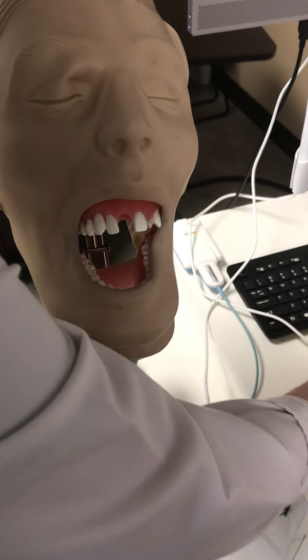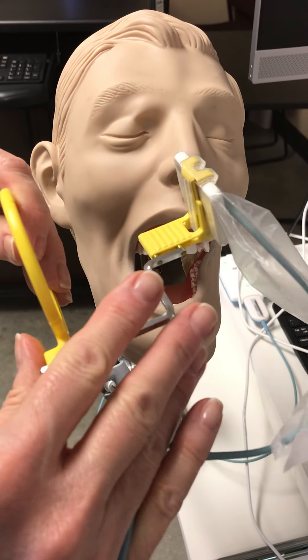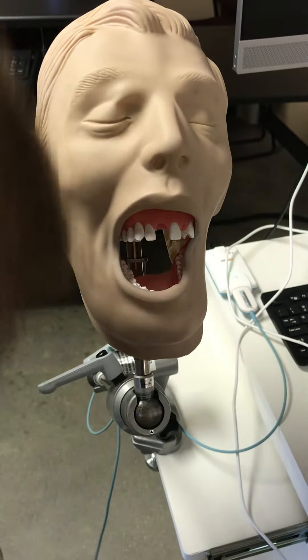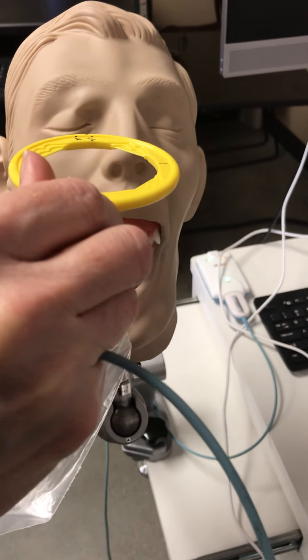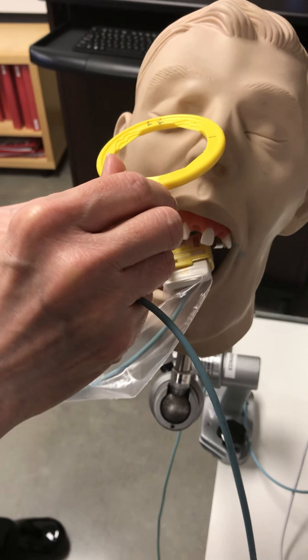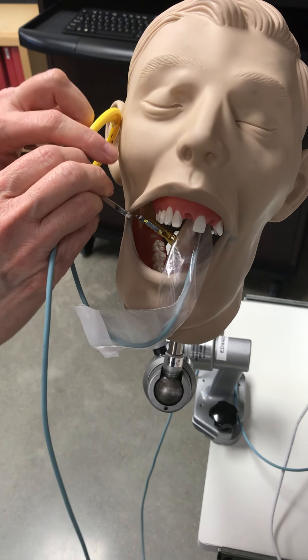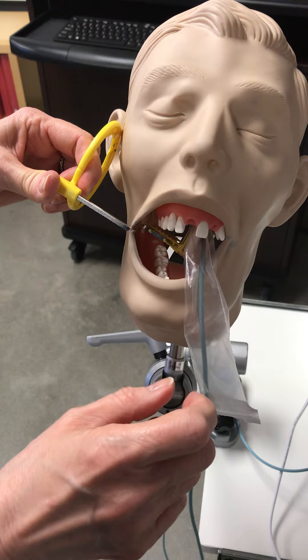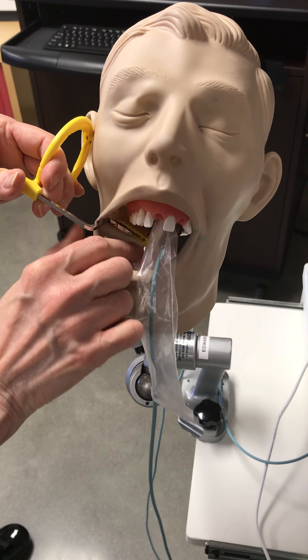You can see him and you're gonna hold this with a pinky hold here only — I'm not gonna touch any of this. And the cotton roll: don't pick it up off the floor because it's not for patient use. Go in, push down on the arch below, making sure that the bar is to the side. Push down sideways, roll the cheek out, place it against the arch, and let the wire go. Take your cotton roll — so much easier — but lock it in.